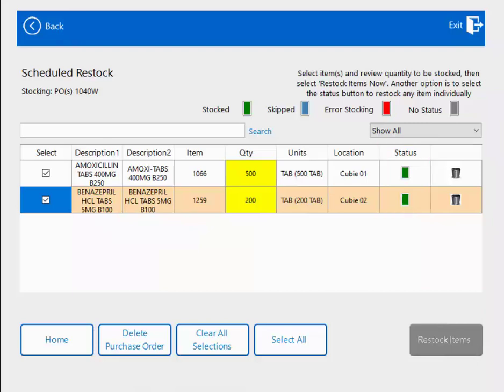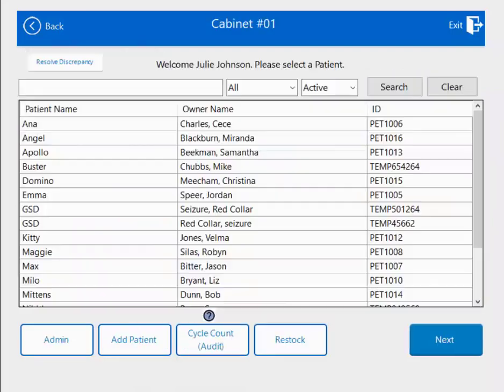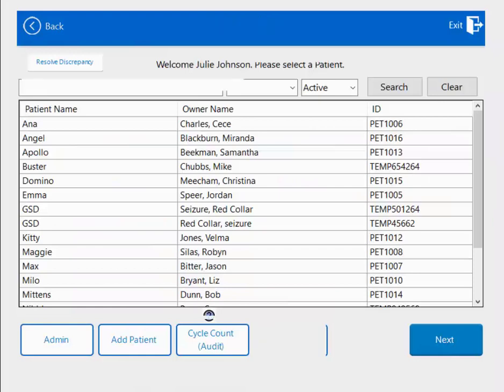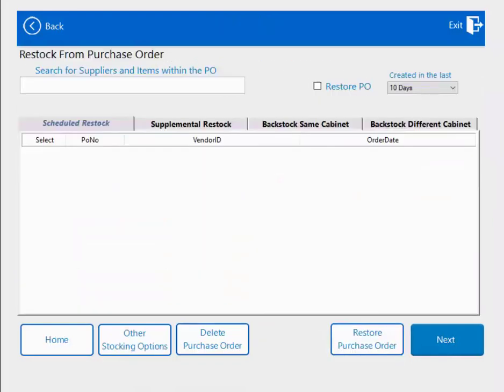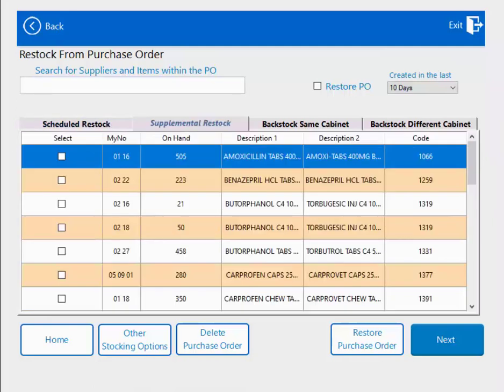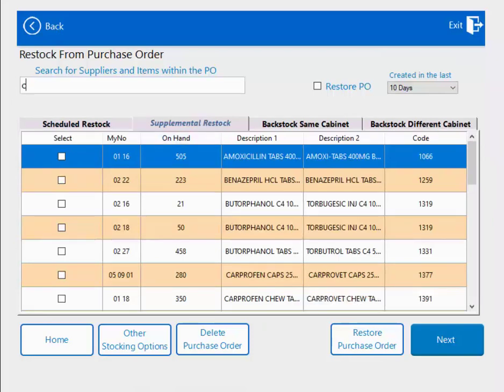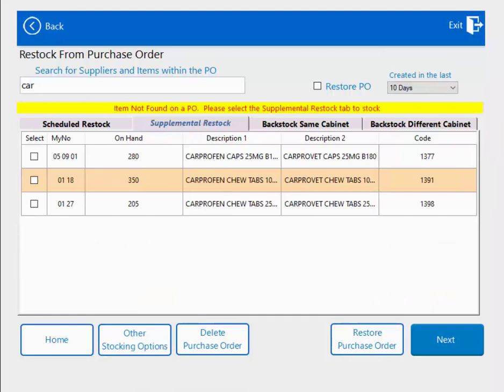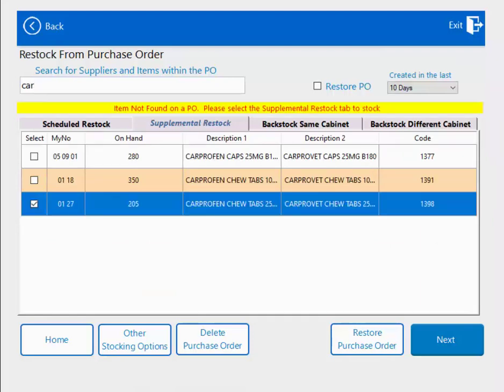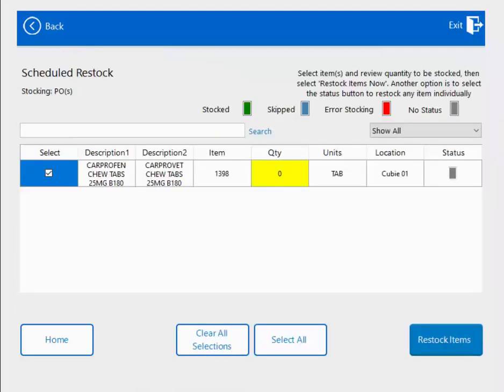Now let's take a look at a supplemental restock. I'll hit the home button, hit restock again, and notice that my purchase order has disappeared because I restocked it. I'm going to click on supplemental restock, which gives me a list of everything assigned in this cabinet. I'm going to use my search bar to look for Carprofen, restock this one, and hit next.